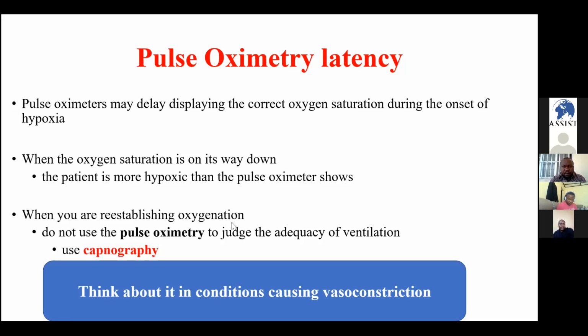I think this is very crucial in emergency situations where you may lose your paralyzed patient ready to be intubated or already intubated, and you remove the endotracheal tube and do multiple trials, while you have to be patient and wait for more than 120 seconds to have normal readings of saturation.